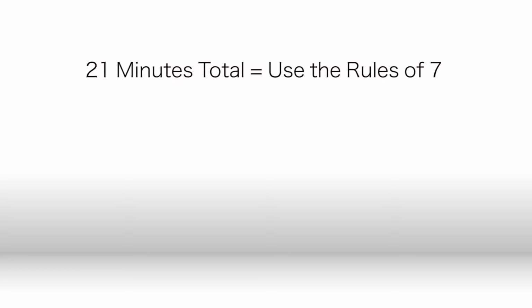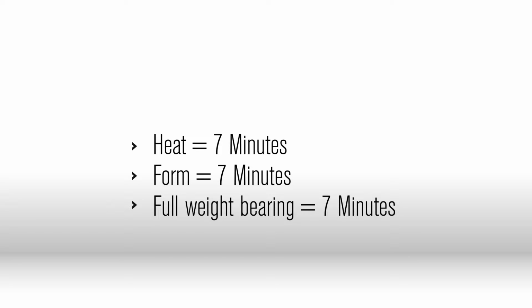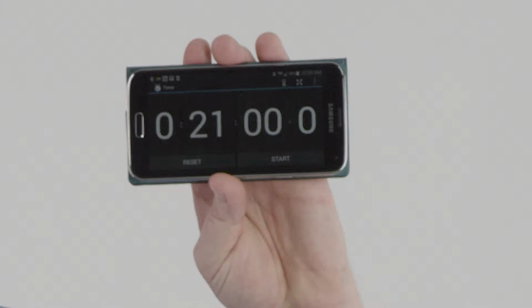The Exos free motion ankle takes 21 minutes to fit, so we use the rules of 7. 7 minutes to heat, 7 minutes to form, 7 minutes to full weight bearing. Set your stopwatch for 21 minutes. Keep it in the ready position.